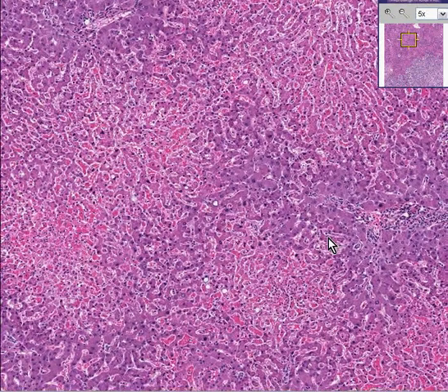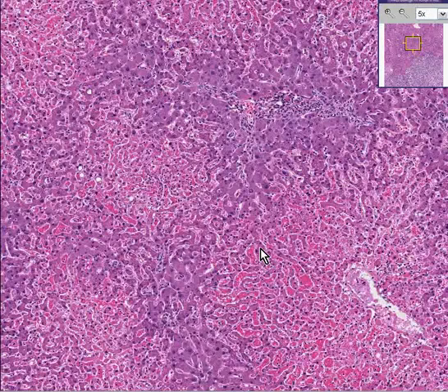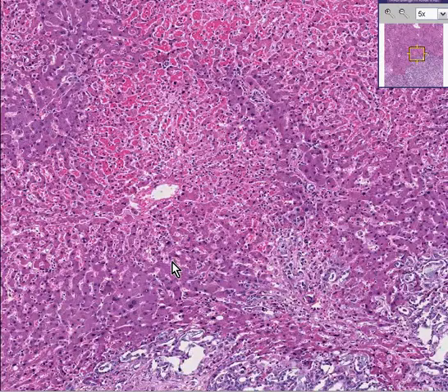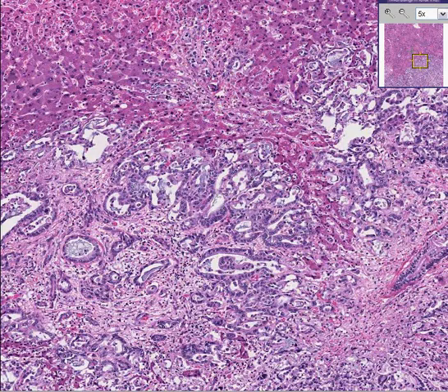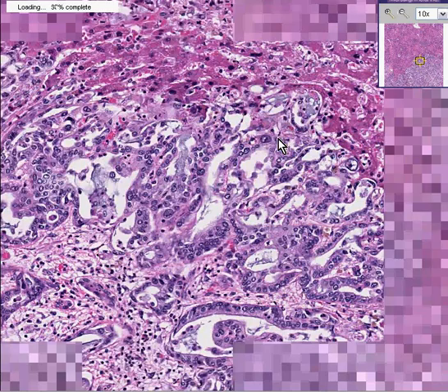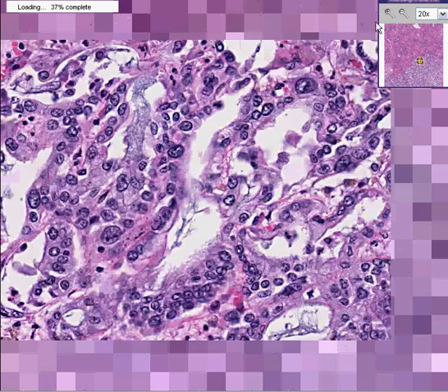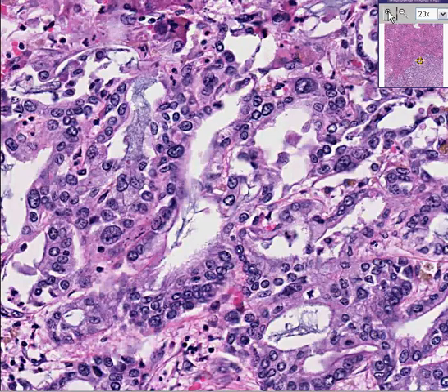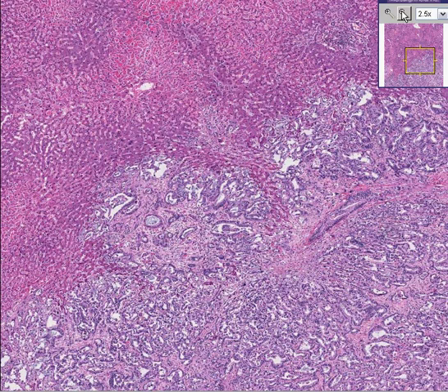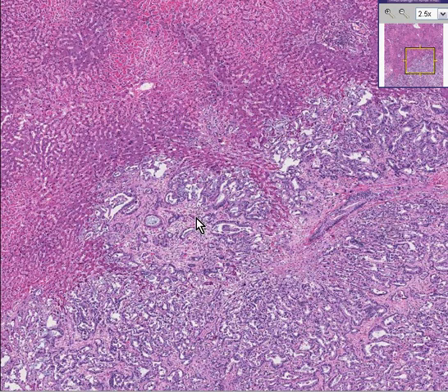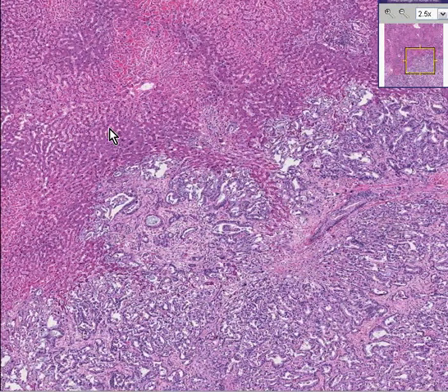In addition, at the periphery of this liver, you could see something that doesn't look like liver at all, but rather it looks like haphazardly, irregularly growing, infiltrating glands with large, bizarre nuclei. This is a classical metastatic adenocarcinoma of the liver. It could be coming from anywhere because the liver is one of the organs that just about everything can spread to. In this case, this adenocarcinoma happens to be coming from the pancreas. And you could see a nice pushing margin here in the liver.